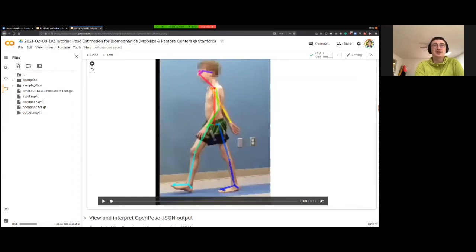So with one video, it's quite challenging to get something as sophisticated as dynamics. But if we have more videos, we could reconstruct 3D kinematics, and OpenSim could actually help us to denoise some of the data. So what we are trying to do now is to use more cameras and combine this 2D key point detection with some optimization that relies on OpenSim models. But there's no direct way to do that. That will be our big next project.